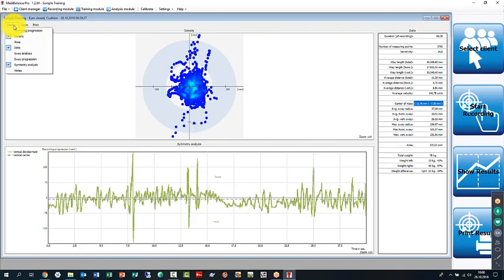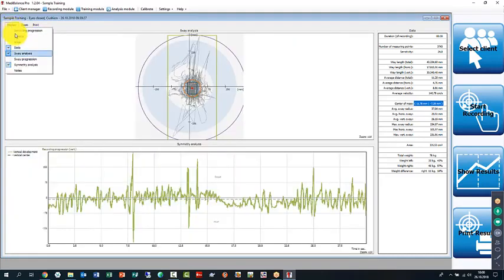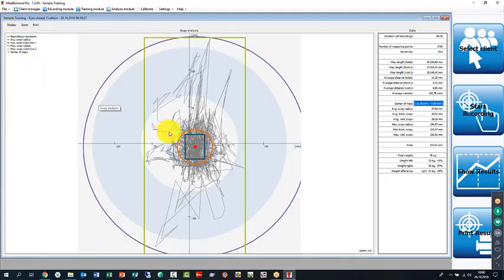because you can only do so much pretense here. Then you have a sway analysis, which gives you an indication for the center of mass, which is the red dot here. Let me take out a few more of those so that you can see things better. So here you see the red dot is actually almost in the center, another indication for somebody just pretending to have a problem. And you can see that everything here is actually focused around this point. So all my movements that I did artificially lead back to the center.